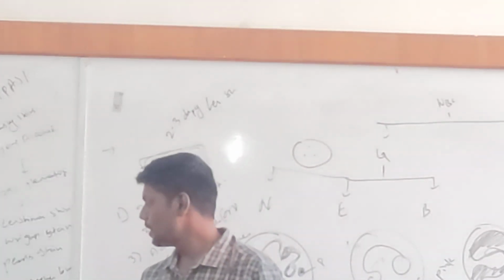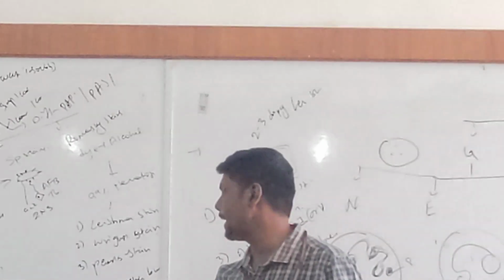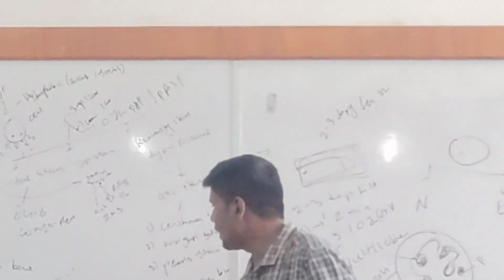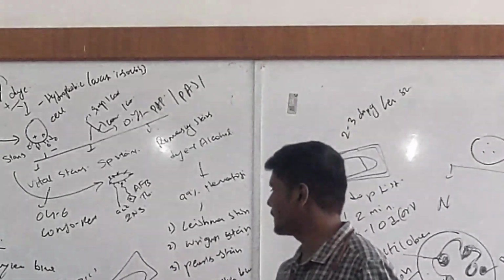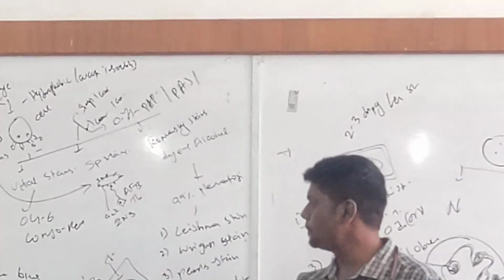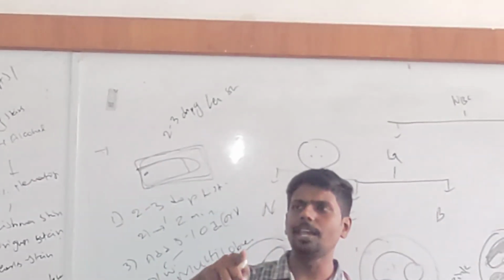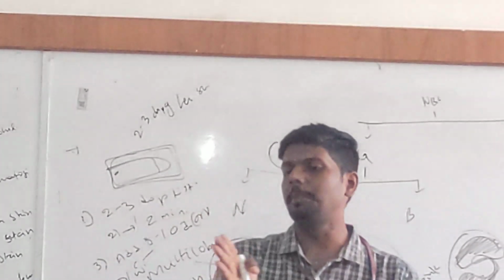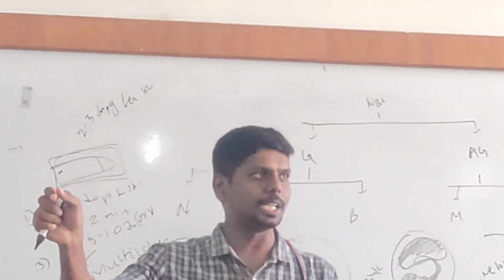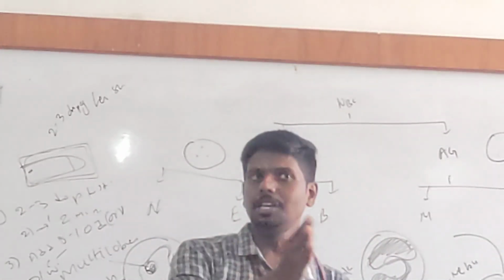Then you will start observing on the microscope. First, you will observe on the 40x. In the 40x, you need to identify the body. Listen. If this is the tongue shape, head, body, tail, you should start observing near the body and tail region. Observe where there is the boundary of red blood cells to white blood cells. Until one boundary, you will see rouleaux formation of red blood cells. At one particular point, you will see white blood cells. Eventually, the field will change.